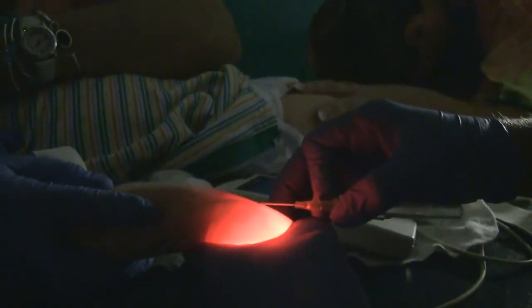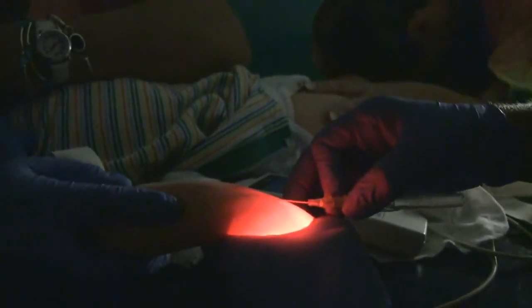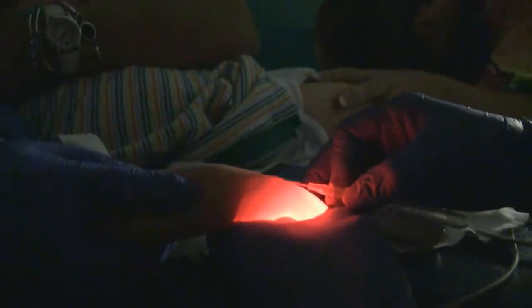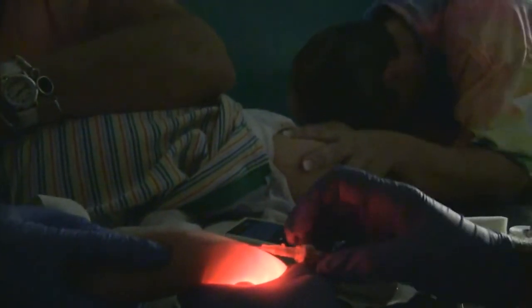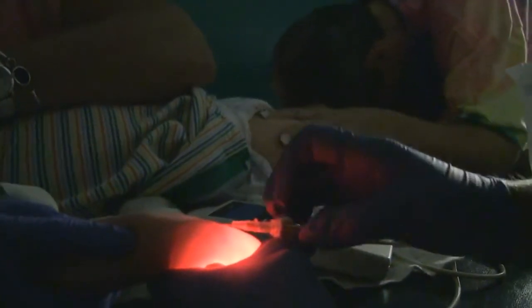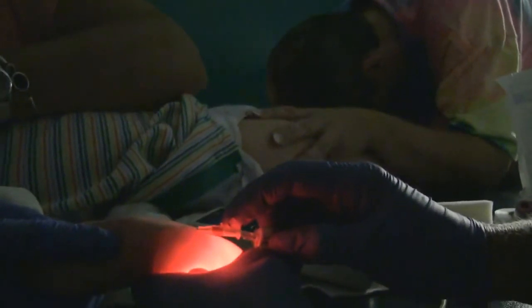I'm sorry honey. Oh no, that's a tender little spot. All right — we have a flash. I'm going to flip my catheter in and turn the lights back on.